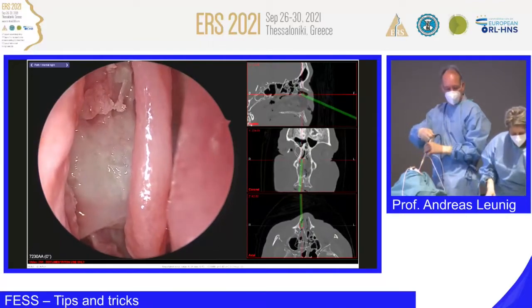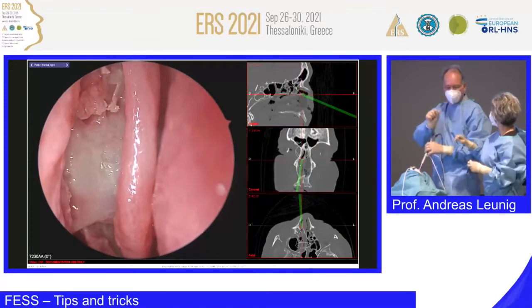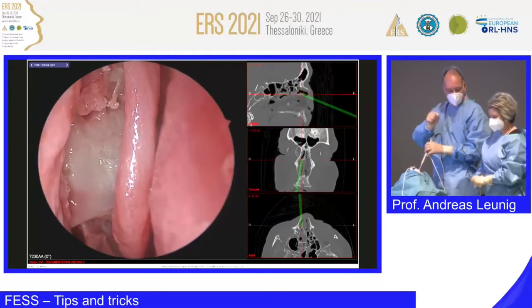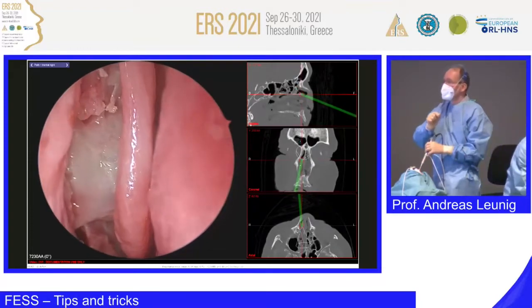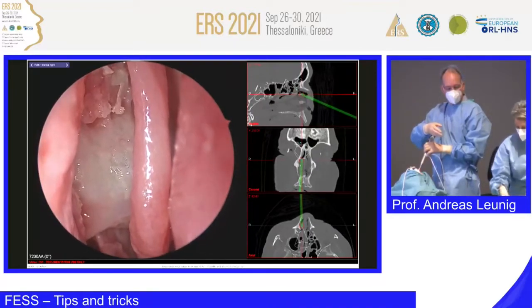Andreas, you've demonstrated beautifully there the two options of doing an uncinectomy, either antegrade or retrograde. Do you have a favored approach? What would be your preference and why? It depends.